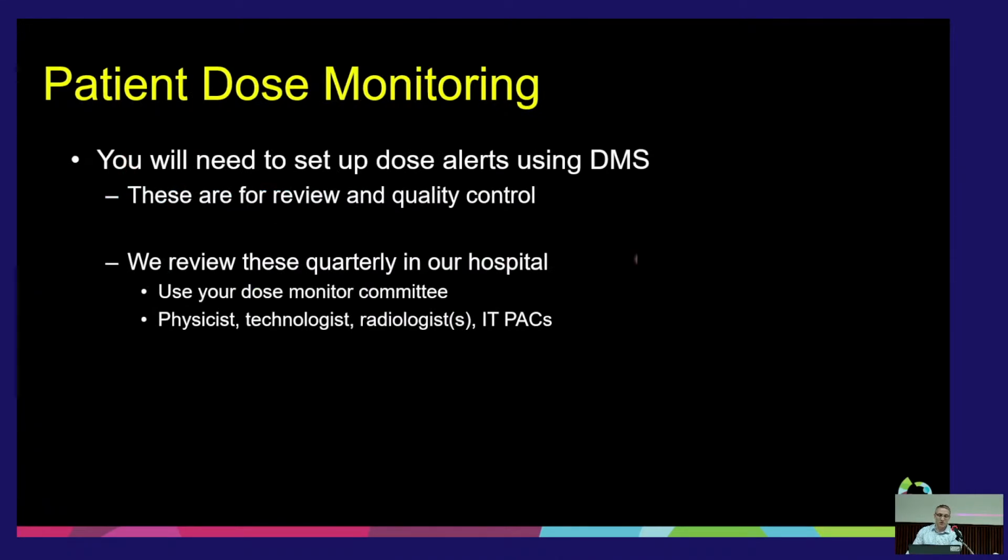All right, so I've mentioned setting up alerts. You want to make sure that your dose monitoring software can set up alerts, and this will be helpful when you sit down and work with your dose monitoring committee to optimize your image quality. And obviously we've talked about who should be a part of that dose committee. At least in our hospital, we meet quarterly and we just review the alerts that we get off of our software. And so not only are we trying to figure out why certain protocols are higher than DRLs, we'll also look at the list and say, okay, so for this quarter we had, say, 10 studies and they exceeded these thresholds.